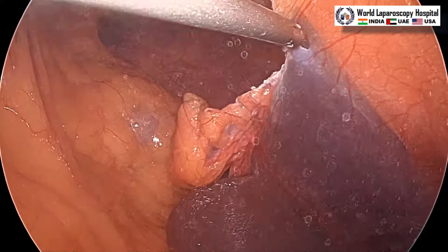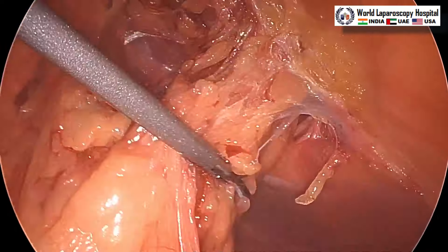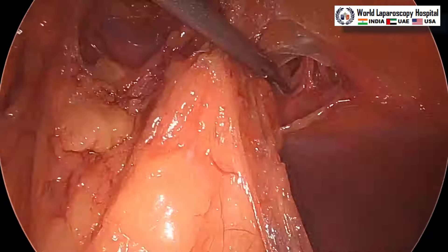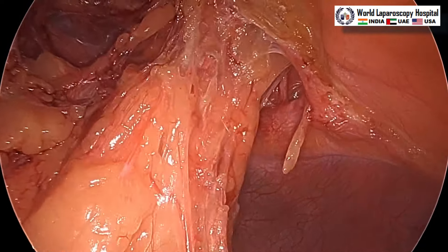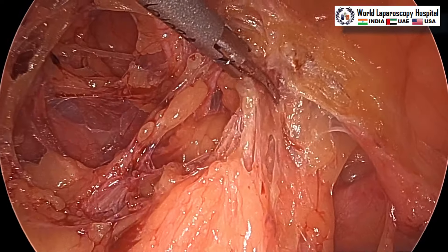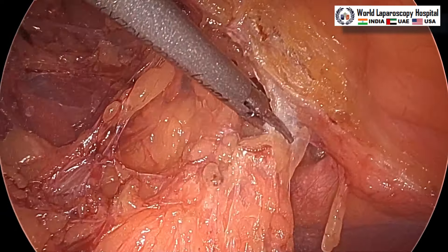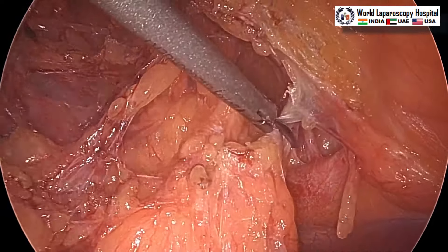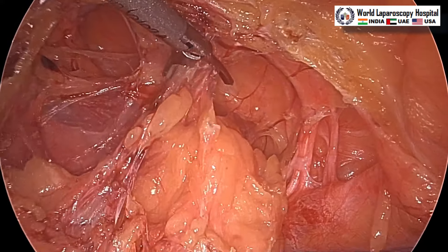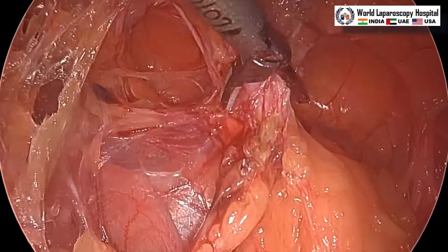LigaSure is actually a vessel sealer. We have now reached the membranous part of the falciform ligament. We can see this is a type of Swiss cheese hernia — there are multiple hernias with interconnecting bridges. These types of hernia are easier to repair because with one large hernia you have to do IPOM Plus or component separation. But in Swiss cheese type of hernia, once you put IPOM it works fine because these inter-herniation bridges give you a lot of strength and support for your intraperitoneal onlay mesh.